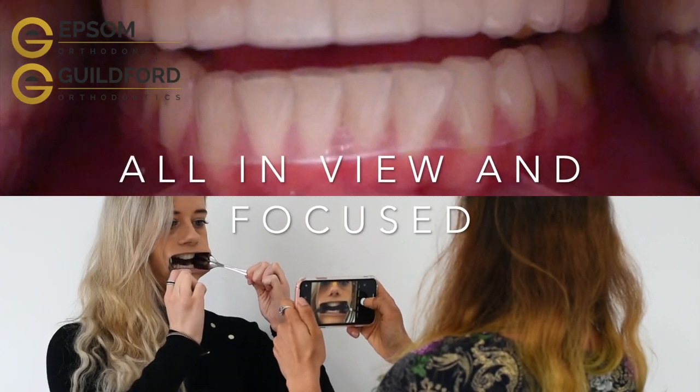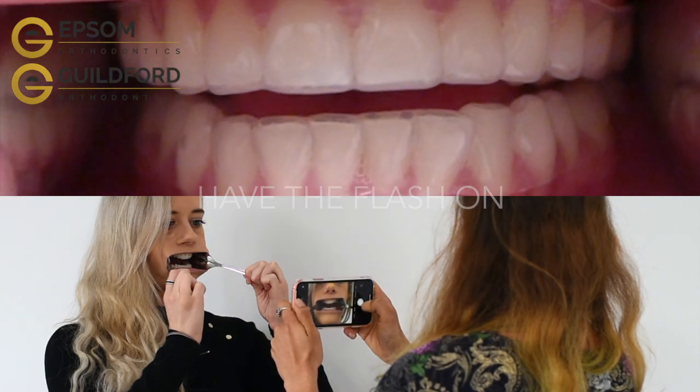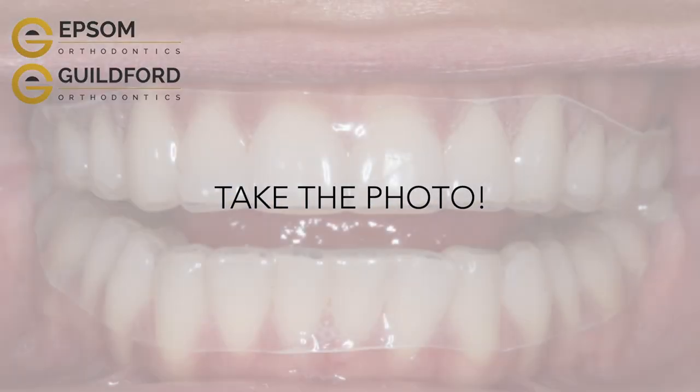Once all is in view and in focus like this, have the flash on and you're ready to take the photo. Thank you so much for watching.